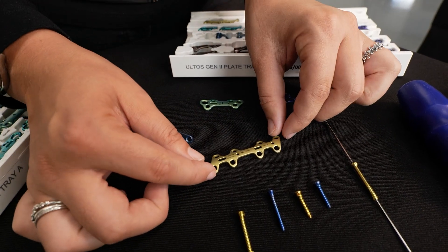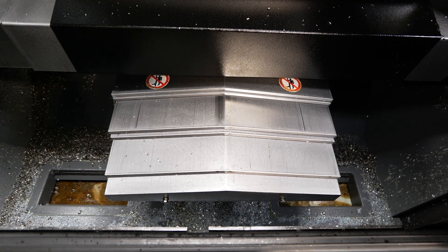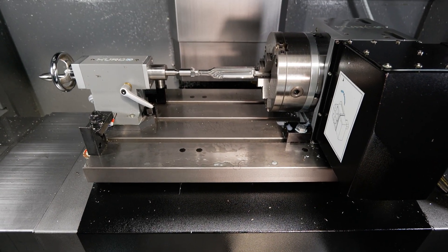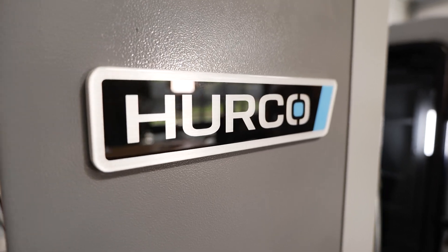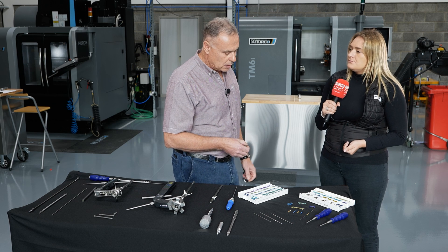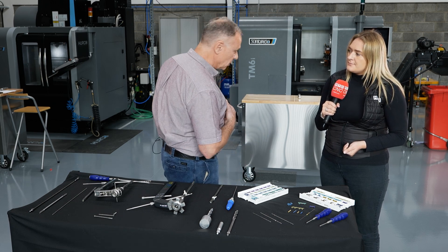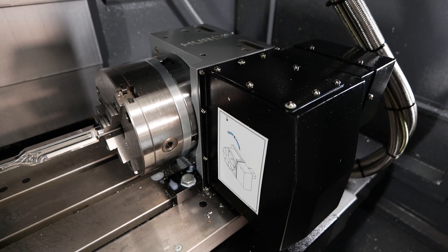How are these parts being made at the minute? Basically they're milled. Most plates are made from titanium alloy and these plates are milled from billet material, done on particular machines like a four or five axis milling machine.